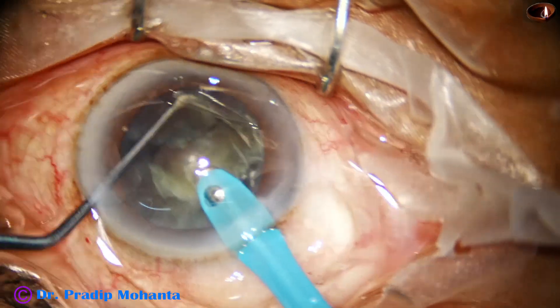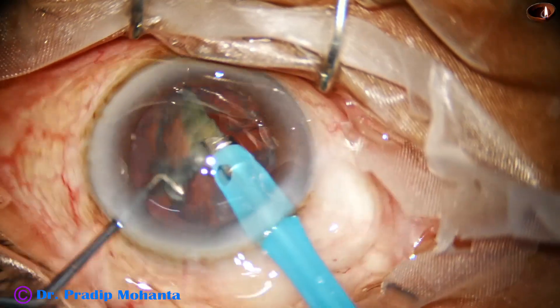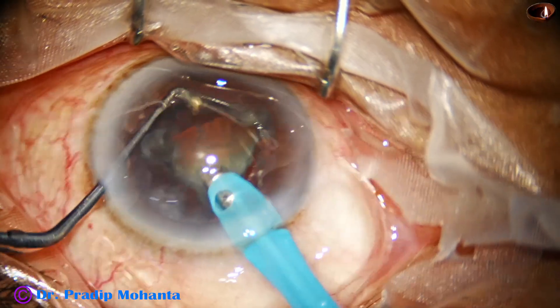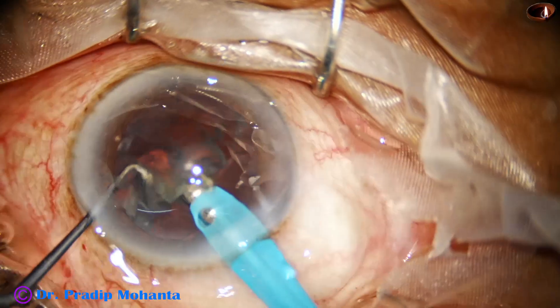Soft cataracts up to grade 2 nuclear sclerosis, or even between grade 2 and grade 3 — up to grade 3, you can divide the nucleus in this way.